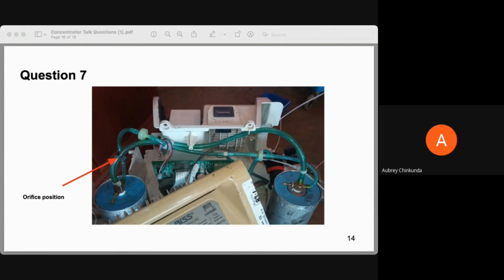If no air is introduced into the depressurized bed, the zeolite releases the nitrogen at a lower speed, such that some of the nitrogen remains in the bed until the next cycle comes. If the cycle duration is maintained, the filtration process is affected. Therefore, you have to increase the cycle duration if you are not introducing air into the depressurized bed, so that you can let the zeolite release all the nitrogen. However, this is not good because for a continuous smooth flow of air, the cycle has to be as fast as possible.